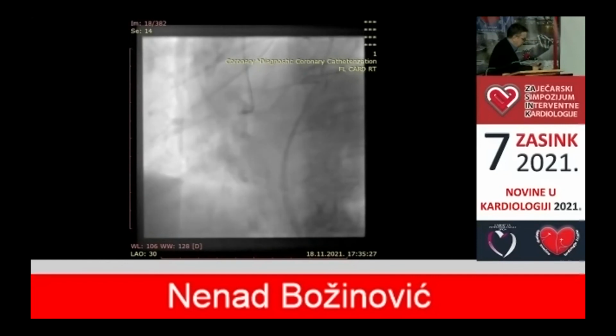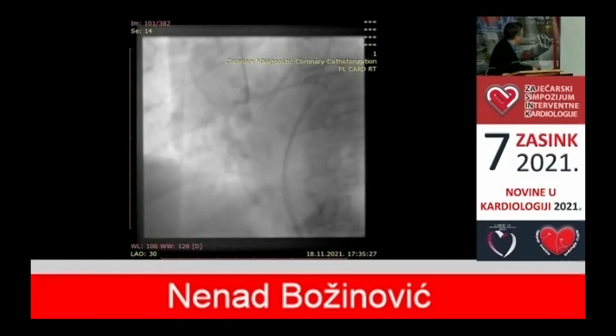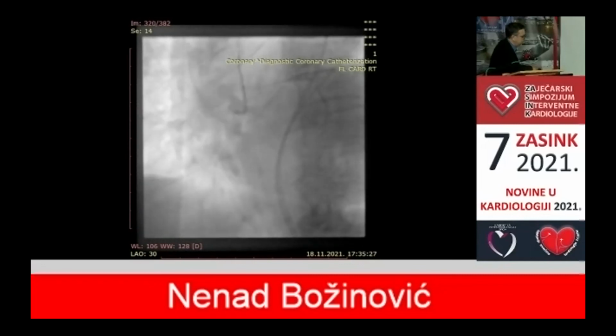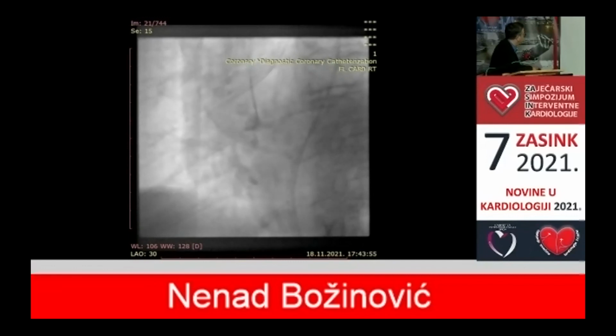And this is another story. I put my Fine Cross now here. In the previous procedure, I was there with the Fine Cross. Now I'm with the Fine Cross in the distal part of the occlusion. And after that, I make a tip-in with my retrograde wire to the antegrade microcatheter. When I put my retrograde wire to the antegrade micro, then I push forward this microcatheter. Now I have a retrograde wire and 2 microcatheters.